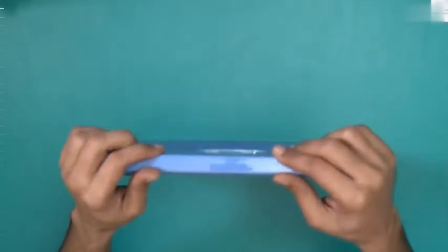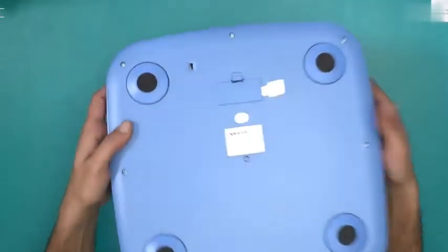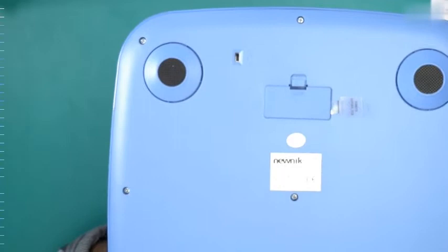This is quite a thin weighing scale compared to some of the other personal scales in the market. There are a couple of things here — this is the unit switcher. There are three units you can switch between: kilos, pounds, and stone.